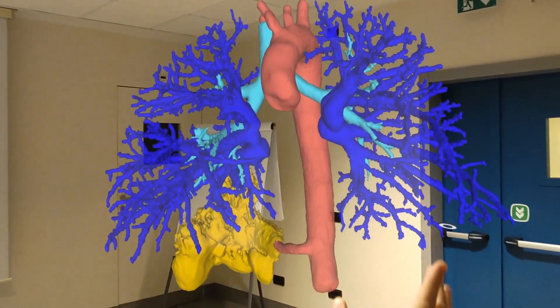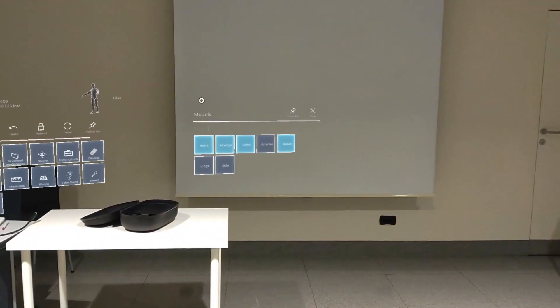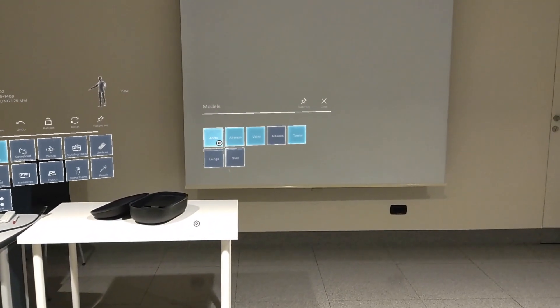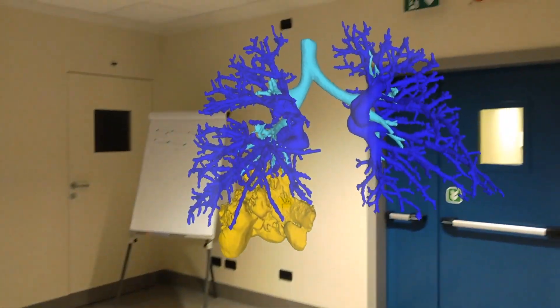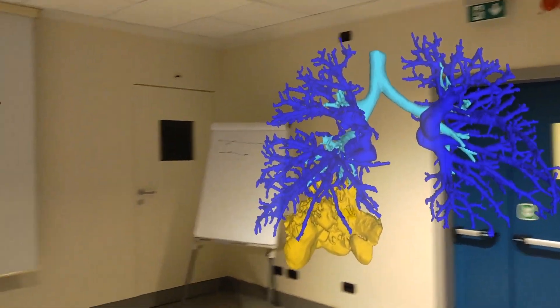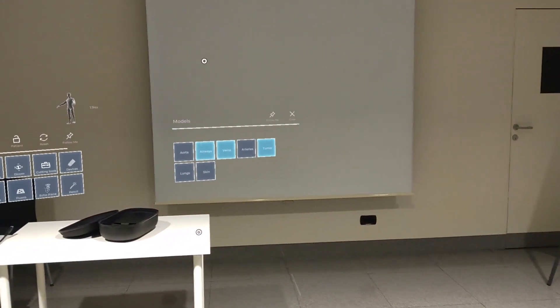We then remove the arteries to better visualize only the bronchial tree in light blue, its relations with the sequestration, and the feeding artery course.